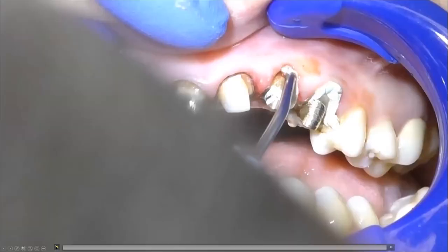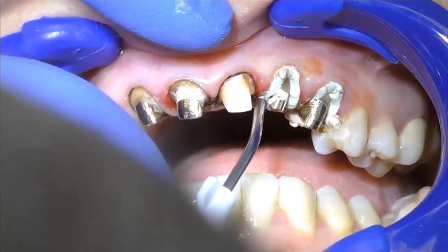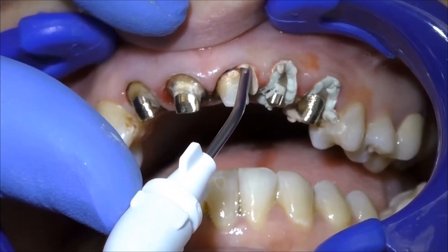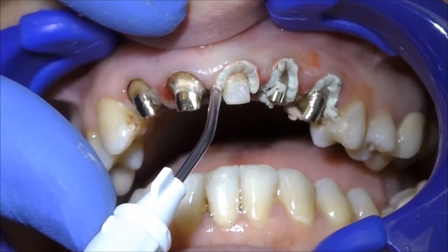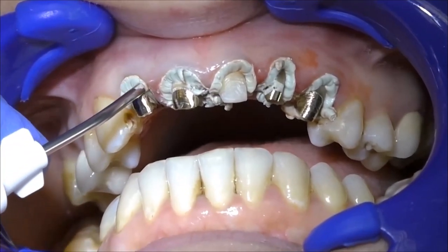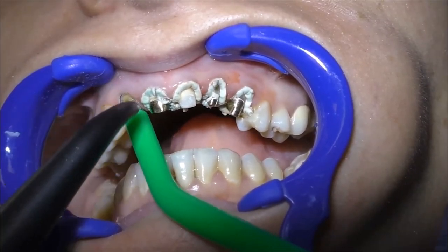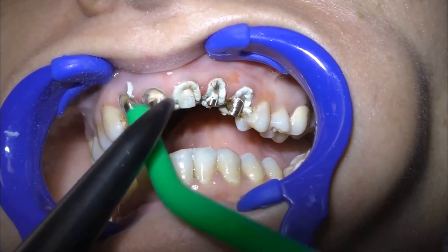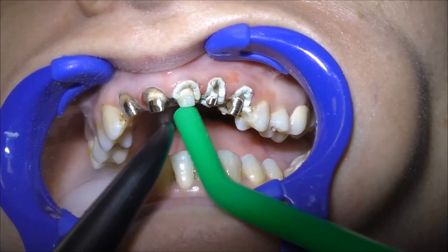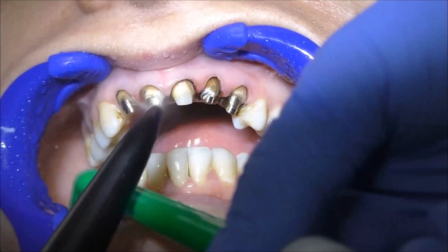Let's see how Access Edge performs. You inject the material into the gingival sulcus — notice the gingiva getting whiter as you apply the material because of the vasoconstriction. After two to three minutes, wash thoroughly with a lot of pressure. Don't be afraid — you'll have no secondary bleeding. After that, dry the field and perform the impression.